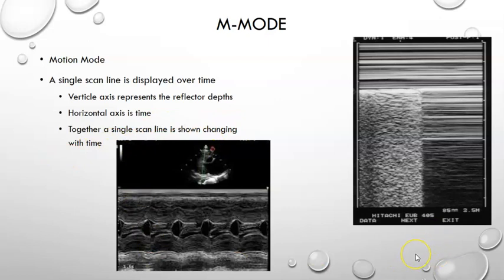And we can do that with a lung example. So here is a picture of a lung, an M mode of a lung. We see the near field muscles, and then we get to the pleural space and we see the reflections of the lung that occur from breathing, the changes from muscle tissue to lung tissue. And this is known as the marching ants view down here.